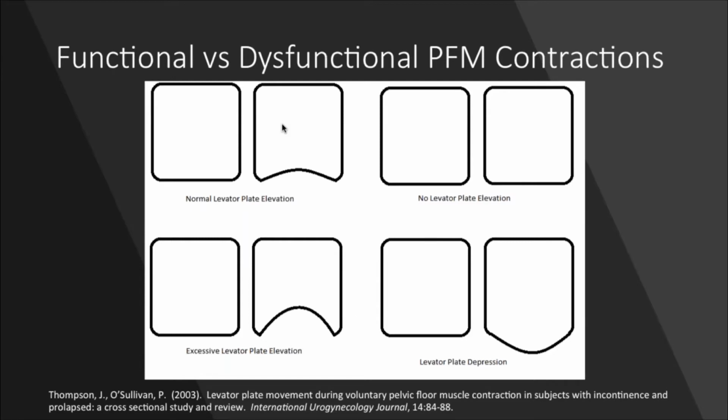So moving on to how we would utilize real-time ultrasound when assessing pelvic floor musculature. You can see in our image here we have a picture of the bladder. The bladder is a fluid-filled structure, so it's going to be anechoic or black on your image. And then you'll see the levator plate underneath the bladder. You'll see a more hyperechoic shadowing underneath the bladder. That's called enhanced through transmission that you see when the sound waves are passed through a structure filled with fluid such as the bladder or a cyst.